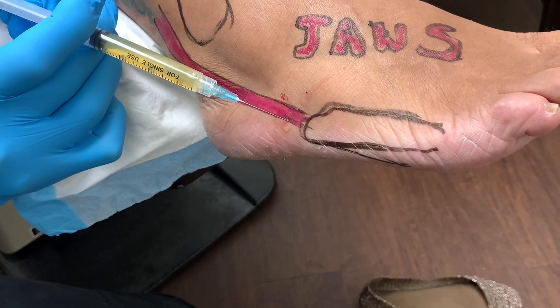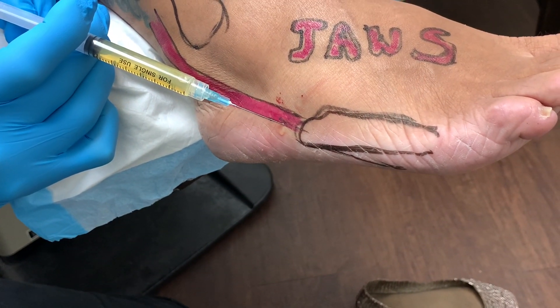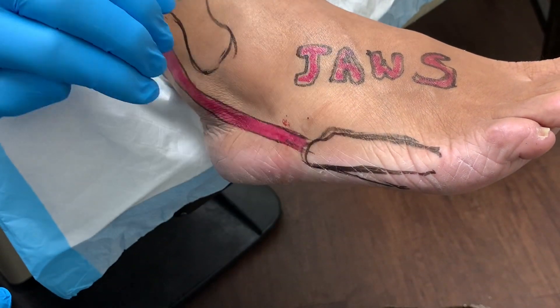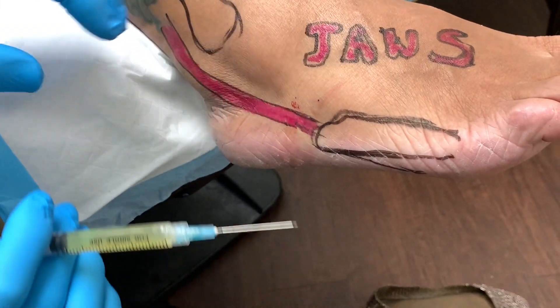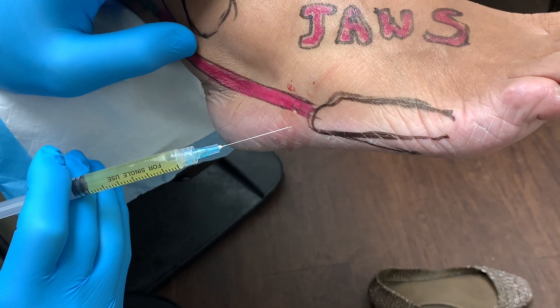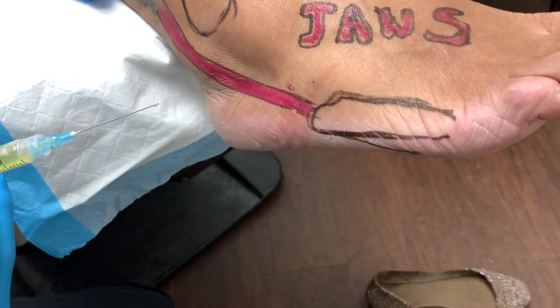I like to really infiltrate slow. This is not like a cortisone injection. I like to redirect, right? Because the tendon, when it attaches here, it's like a fan — it fans out. It also inserts underneath. Here we go, patient. Pain? Pressure or pain? You're going through some discomfort because of what I already infiltrated.